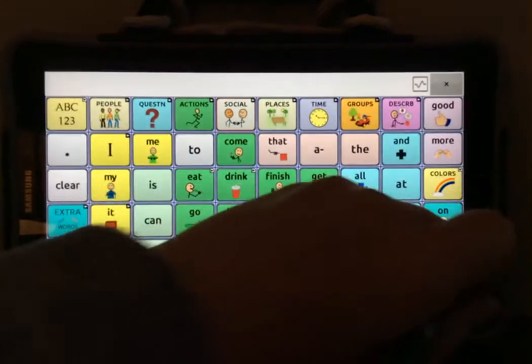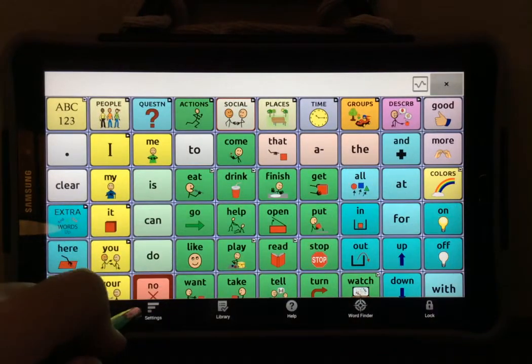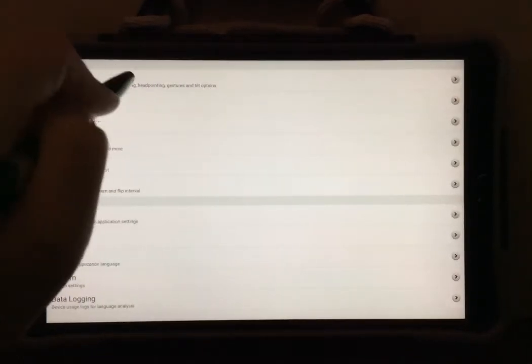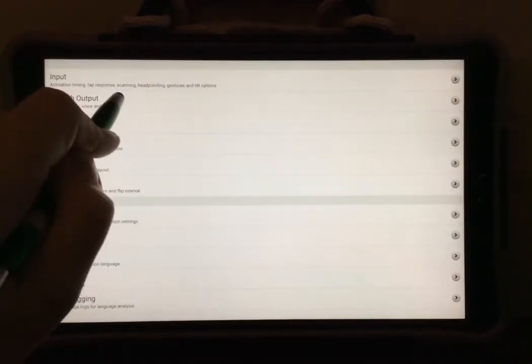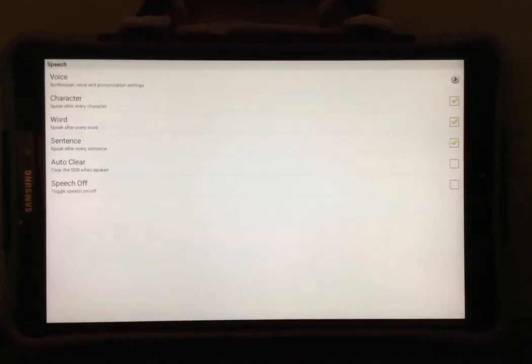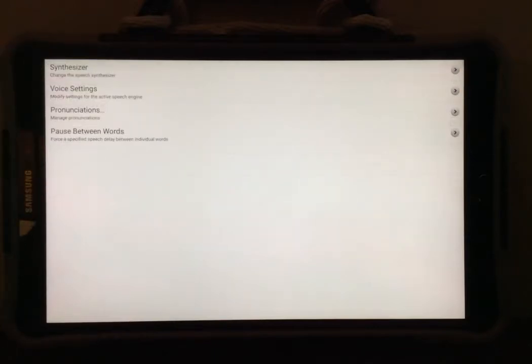Then you're going to select the menu button again, and this time select settings. You're going to go to speech output, then you're going to go to voice, then you're going to go to pronunciations.